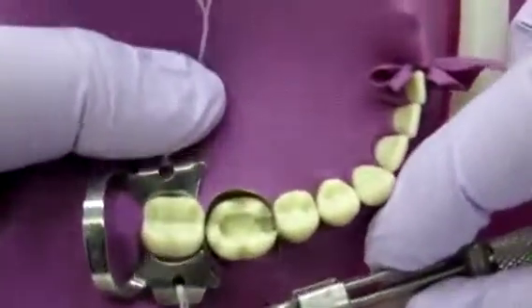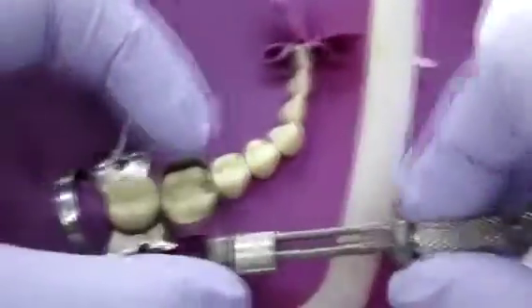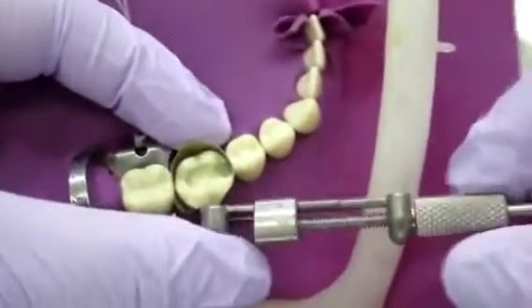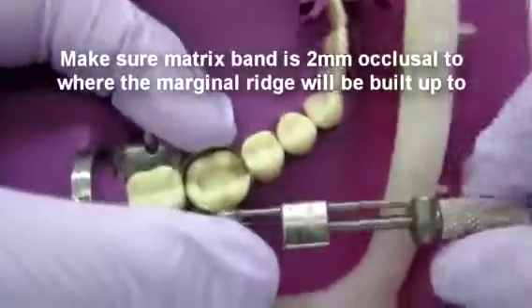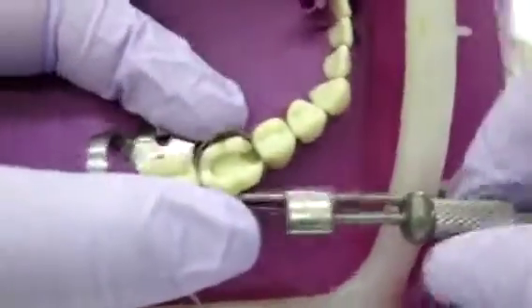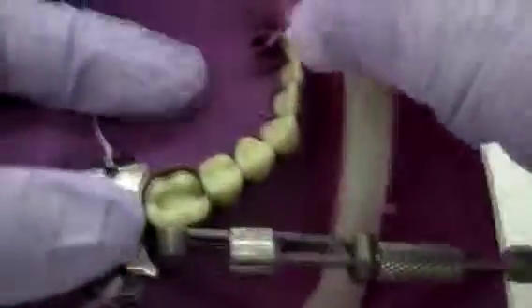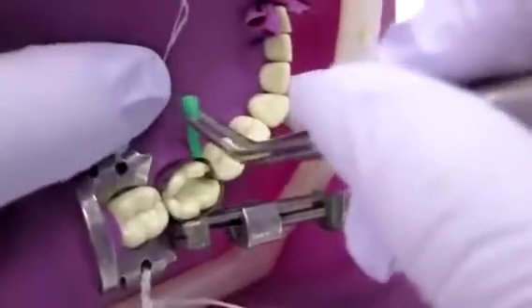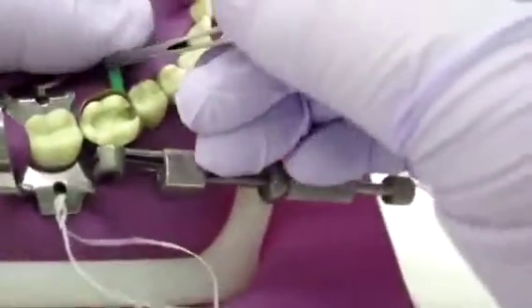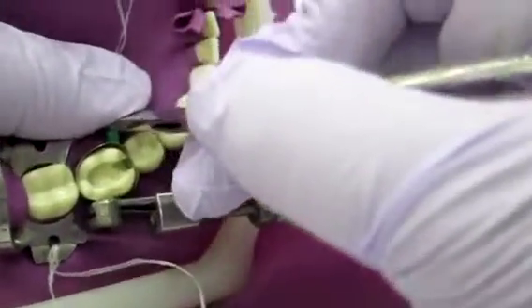Make sure you push it in and make sure it goes down. Make sure there's no rubber dam stuck in between the band and the tooth. Then you're going to take the larger knob and start tightening it. Tighten the band until it's nice and snug — you can pull it side to side before you tighten it all the way so that you have a nice contour of the band against the tooth. Once you get that done, you're going to place your wedge. Wedges come from the lingual — flat side towards the gingiva, pointy side towards the occlusal. Push it in and you want nice, tight wedging because you want some separation between the teeth, that way it accommodates for the band and you have a nice tight contact.